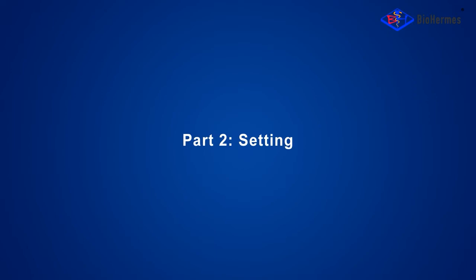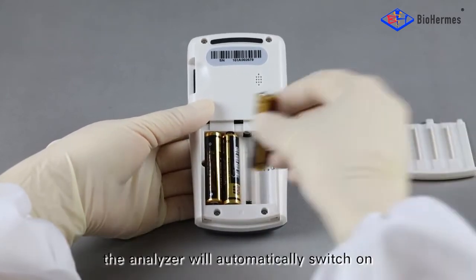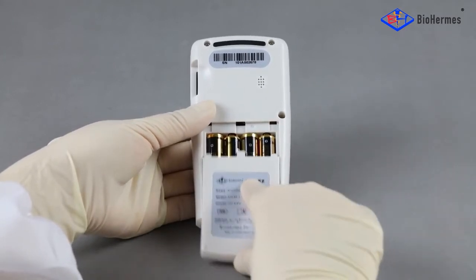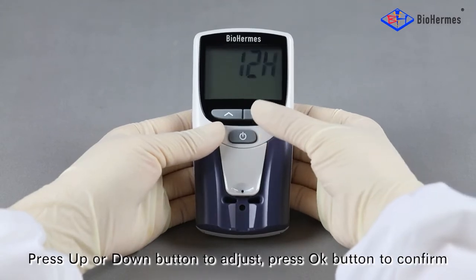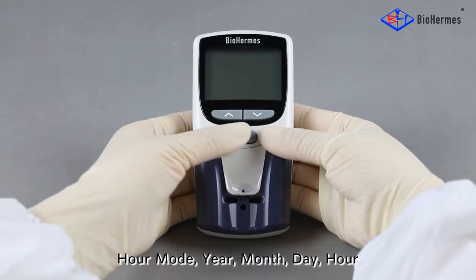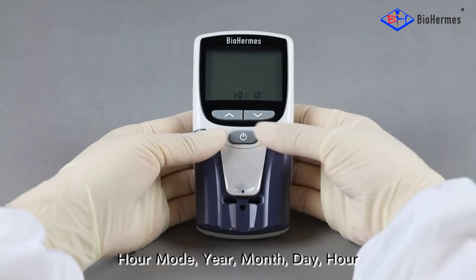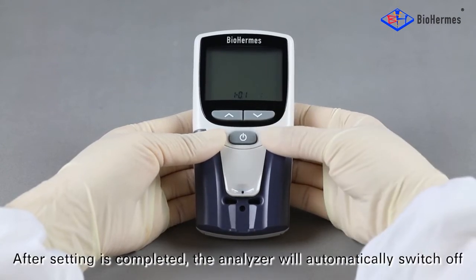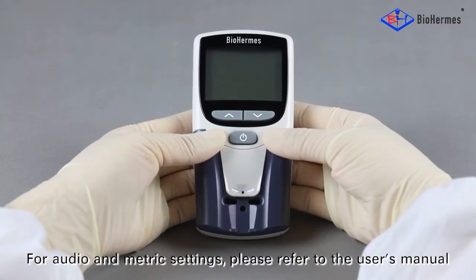Part 2: Setting — Date and Time. When the batteries are installed, the analyzer will automatically switch on and enter into the setting mode. Press the up or down button to adjust, and press the OK button to confirm. Hour mode, year, month, day, hour, and minute will be set successively. After setting is completed, the analyzer will automatically switch off. For audio and metric settings, please refer to the user's manual.